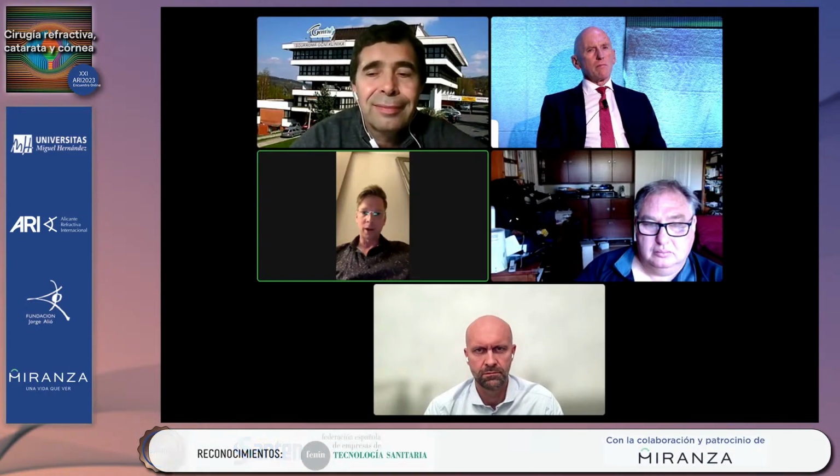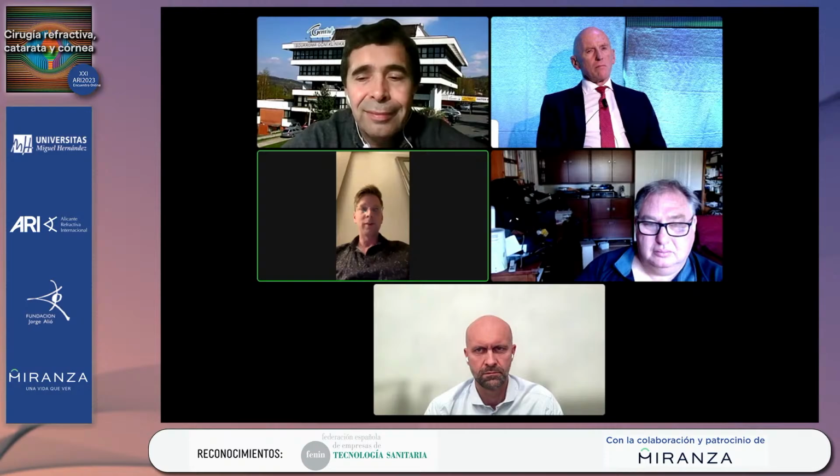So at the moment, I love to do both. In regular cases, we have the huge advantage for premium IOLs with the mountaintop sign or this landmark we can see. This is still something new, and I'm happy that we saw the first part of evidence, and hopefully we will get some more, that it is a new tool that we haven't had before for centration. So this is the part for the regular easy cases. We can improve a lot, especially with premium IOLs like multifocal and toric IOLs.